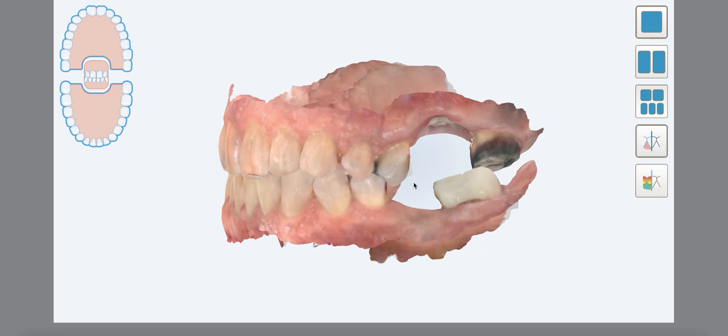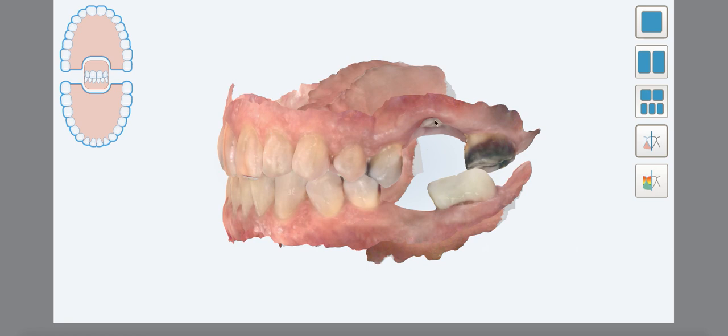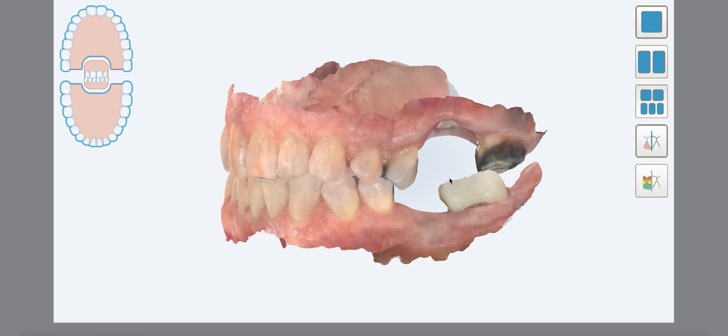The amount of surgical intervention here would be rather significant. It's very difficult, if not impossible, to grow bone vertically with any sort of appreciable volume gain. When I say vertically, from the alveolar ridge coronally, it's very possible to grow vertical bone going up into the sinus, but then that's a different direction. And again, the implant crown that would be here would be rather top heavy. Definitely can be done. If the patient wants that, we can definitely do it. It just comes with some reservation.